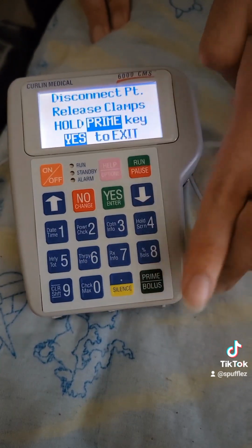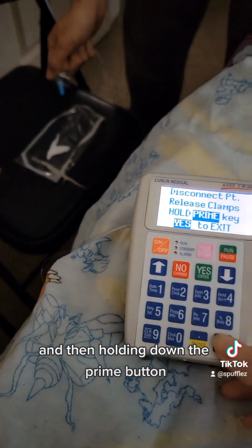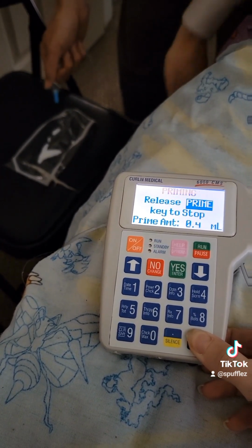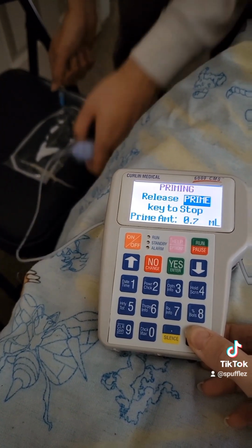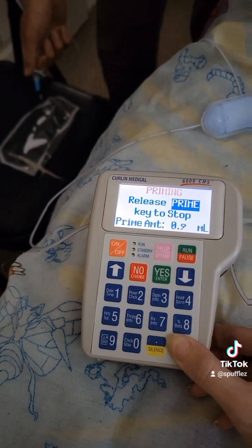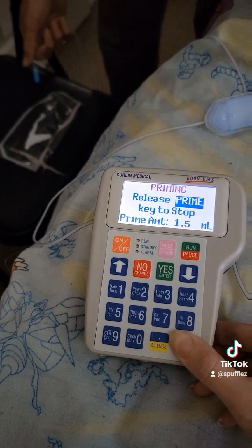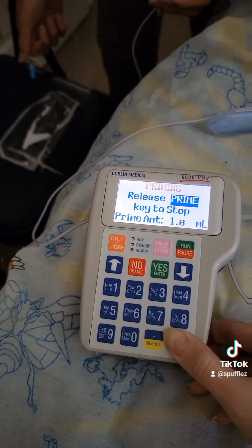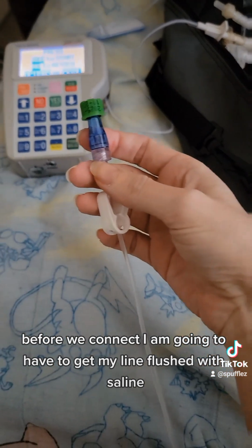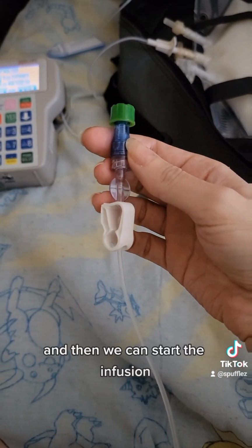Joy. Okay, so we're going to prime it. That just means releasing the clamp down here and then holding down the prime button. Okay, hit a little more. Yep, I can see the air bubbles. So, before we connect, I am going to have to get my line flushed with saline. And then we can start the infusion.